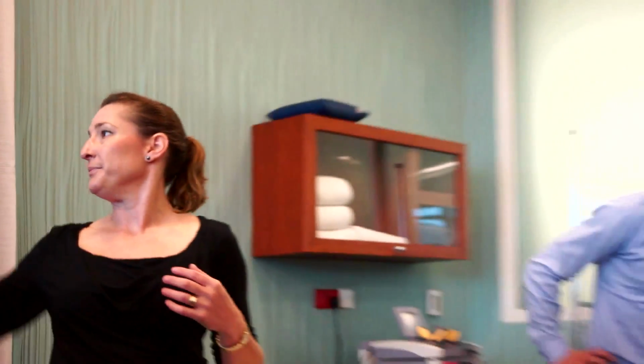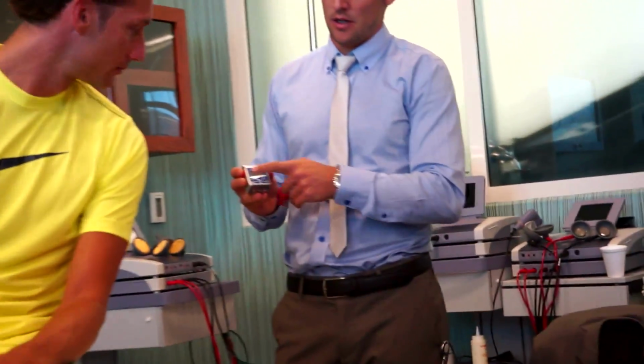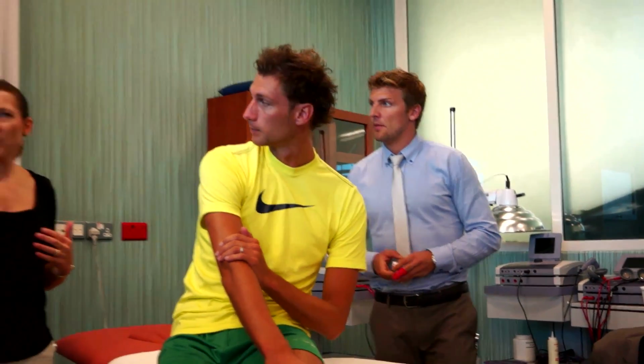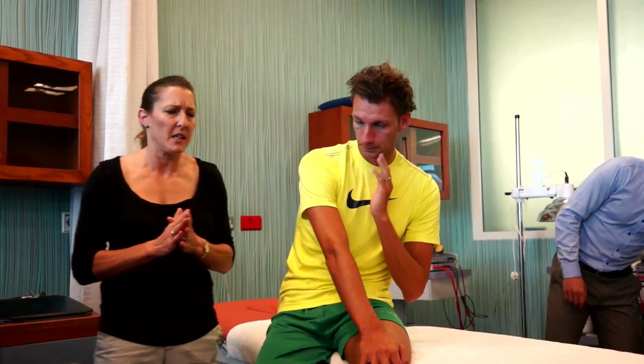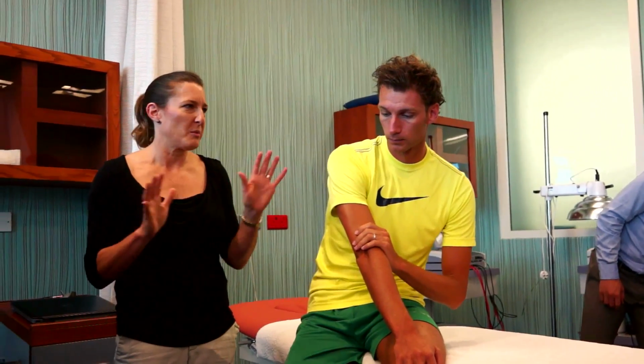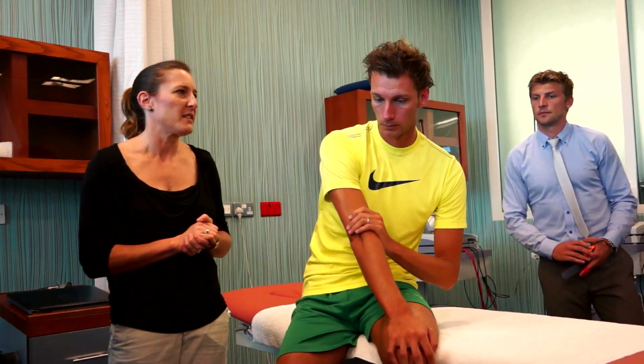Okay, so we chose to use these digital inclinometers, and one of the main reasons for that is that you get an exact measure, so you're not influencing your measure by the way you're holding a goniometer or the way you're looking. So all you're actually doing is feeling the end range of motion. You push a button and then you can look at what you pushed. So that's a more valid way of measuring in our opinion. We're not going to demonstrate internal rotation and hip flexion, because you saw it in the picture yesterday in my slides, and it's just done with the goniometer, and we feel that everyone has great experience with that method of measurement. So just for time, we're going to show the other tests.